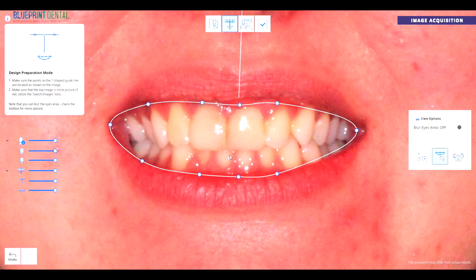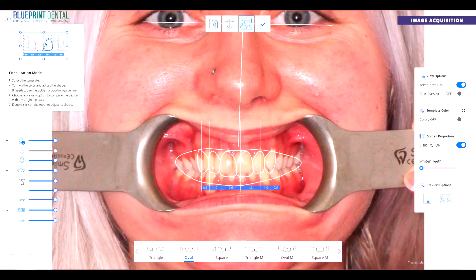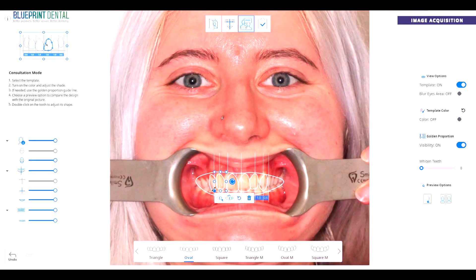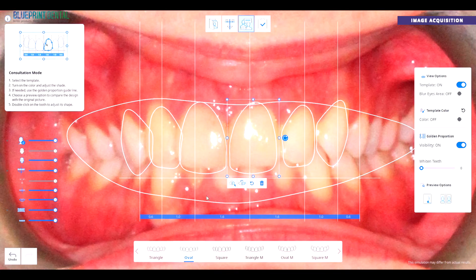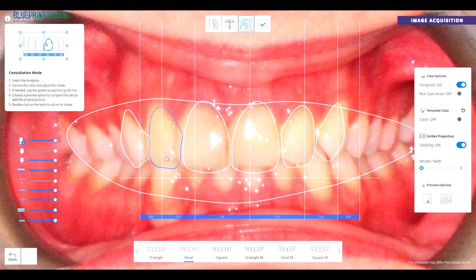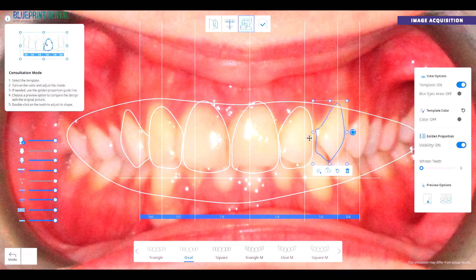As part of the treatment plan discussion, the dentist can use the Smile Design app to show the patient before and after treatment images of themselves, which is a great way of relaxing the patient and building their trust and confidence at the start of their treatment.